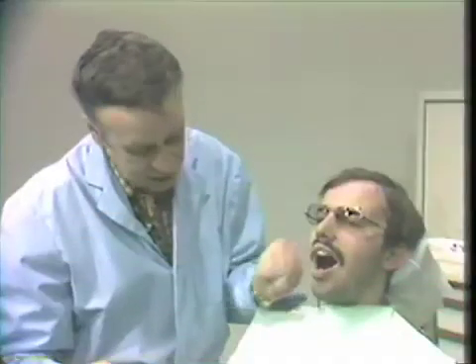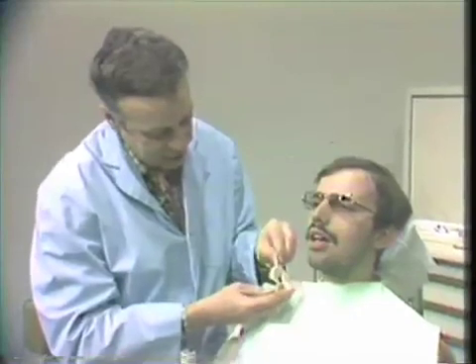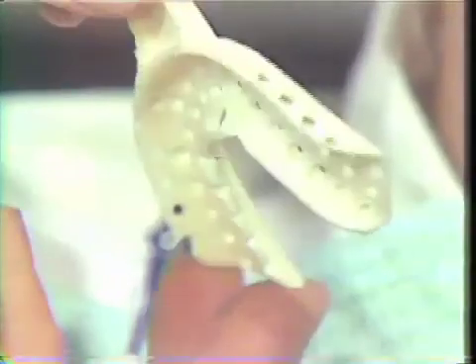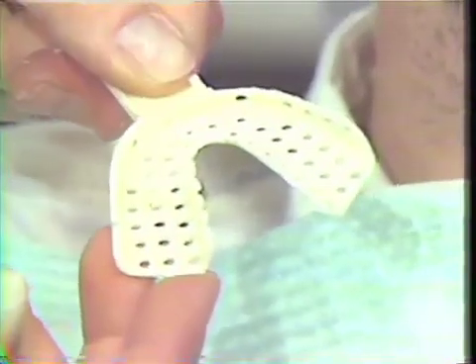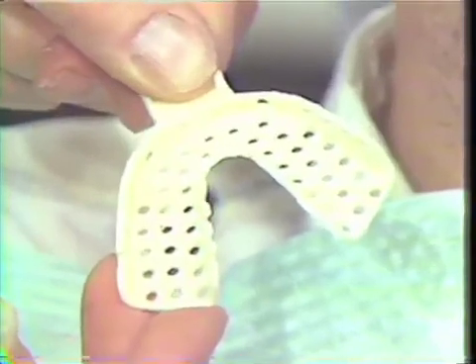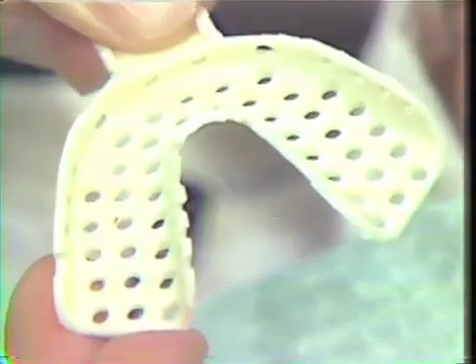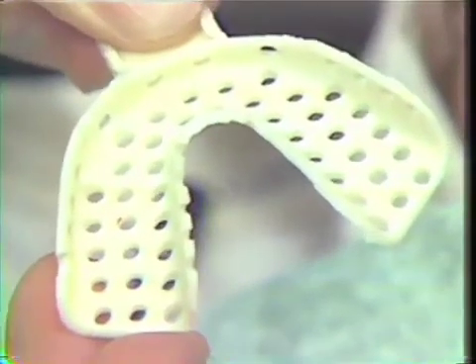And we have taken a stock tray, as you can see here, and cut the flange down so that we have approximately 3 or 4 millimeters of flange. This will be all that will be necessary to register the occlusal surfaces. We'll now mix our fast set stone and apply it to the wax in the mouth and carry the tray into the mouth and register the balance of the dentition.